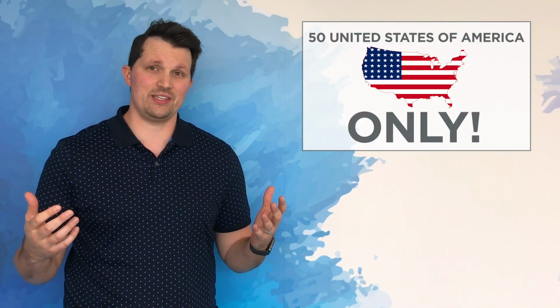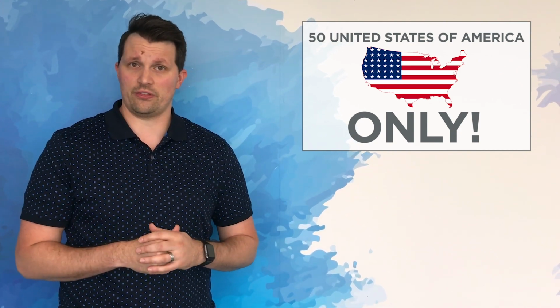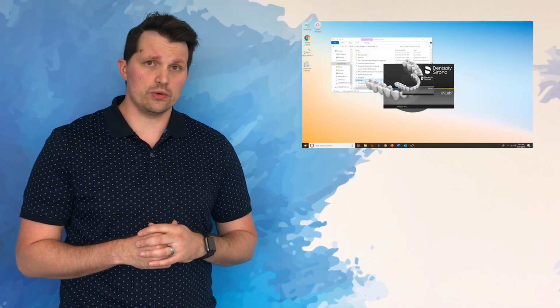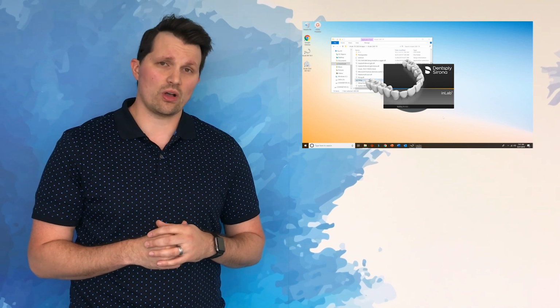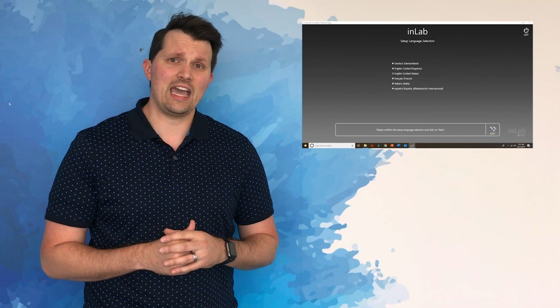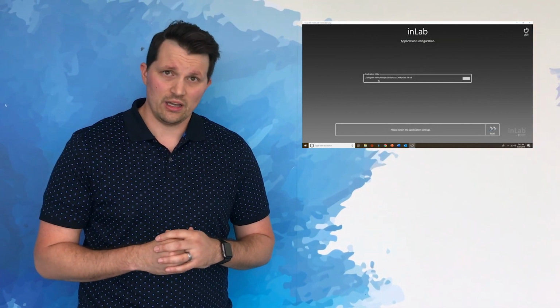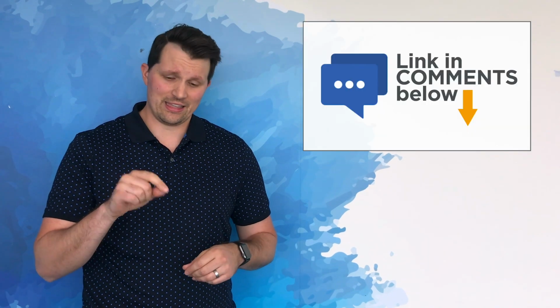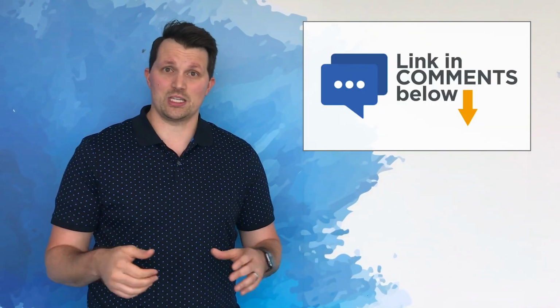That's it. Easy peasy. Now let's talk about how you install the software and some of the self-help guides that we have. So we've created a series of videos that will live both on Facebook and on YouTube that will show you how to install the new software, both the CAD, the applications, the CAM, and Connect Case Center inbox on your inLab PC. I will also post a link in the comments section below with those videos to keep it nice and simple for you.